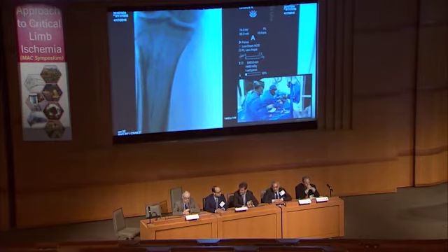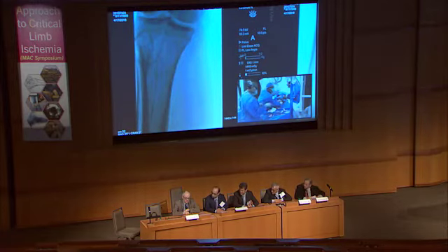But to be honest, I would not treat the distal popliteal at the moment. I would finish the SFA and proximal popliteal, because even if it's unlikely, if you would embolize, the subtotal occlusion would protect the outflow at the moment.